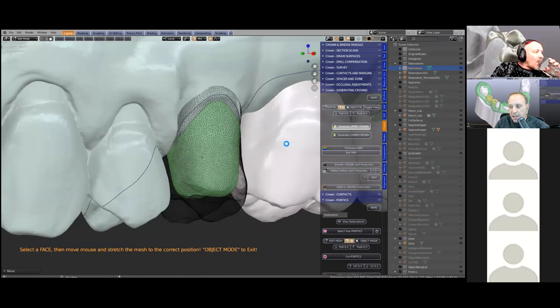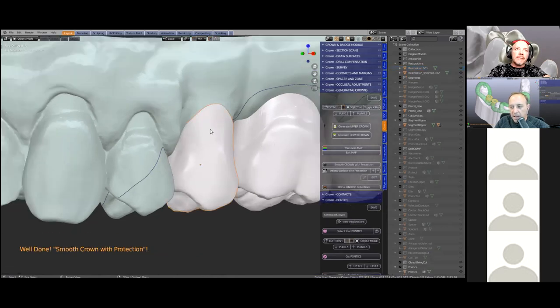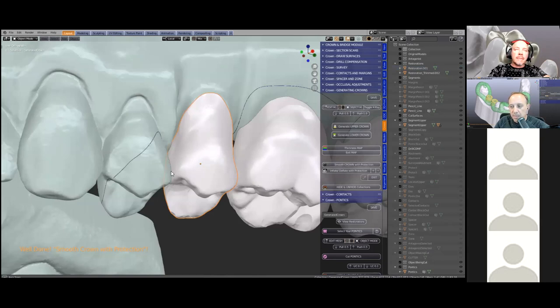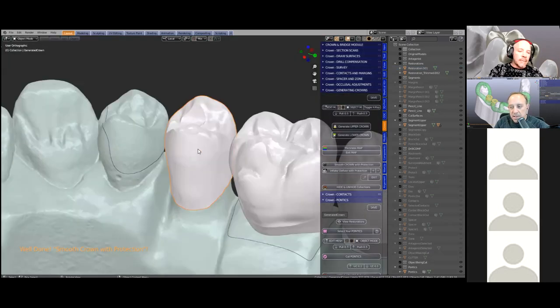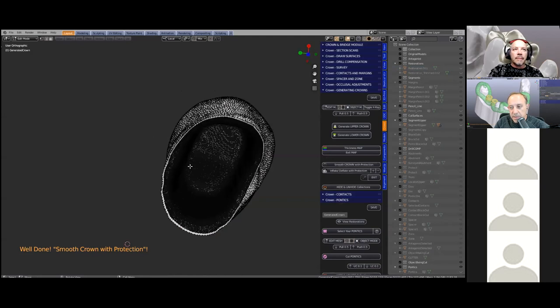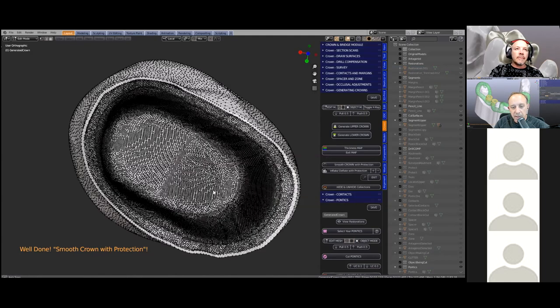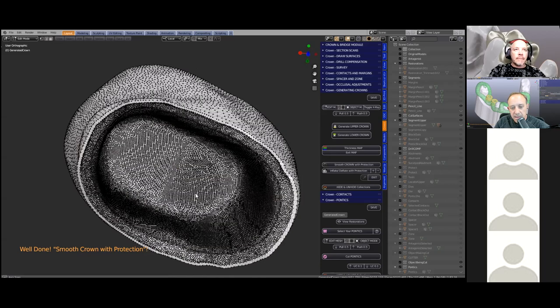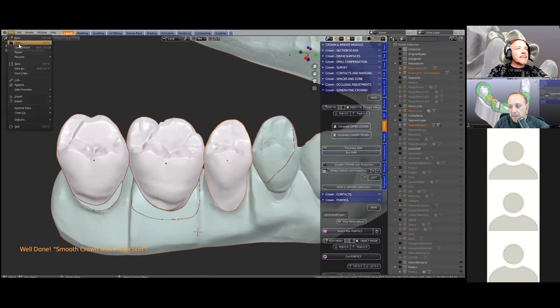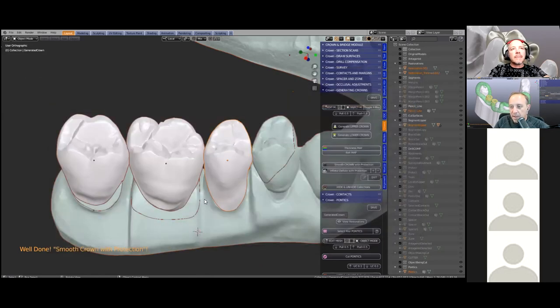The 'generate upper crown' button has been pressed. This takes a little while because there are many calculations taking place — we're trimming out the die spacer, trimming out the blocked-out section, and if you've got drill compensations it will trim those out as well. The tooth has now been adapted to the margin, and in edit mode you'll be able to see the mesh integrity is of pristine quality. You can just make out where the cement space has been trimmed out too — there's a little line going around it.